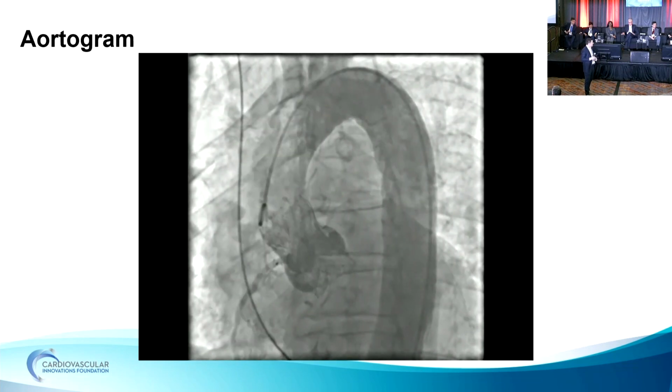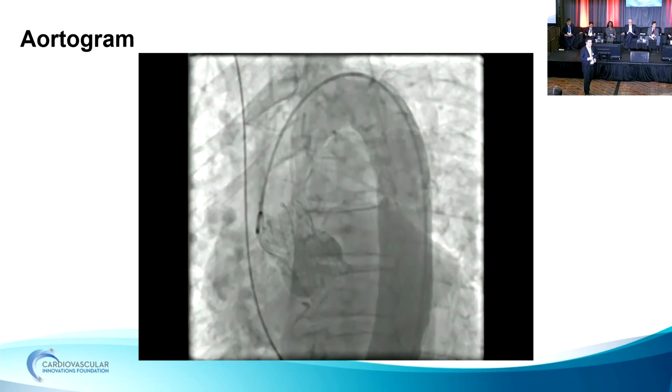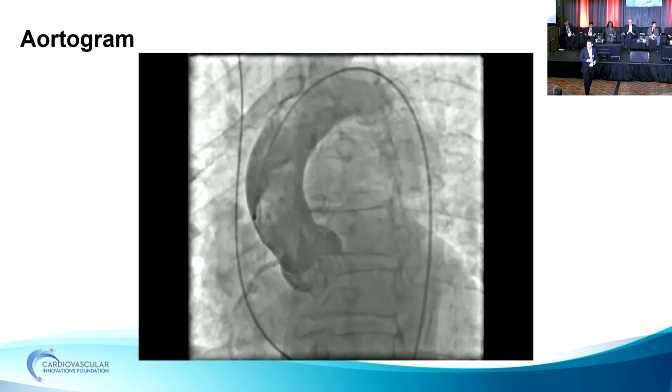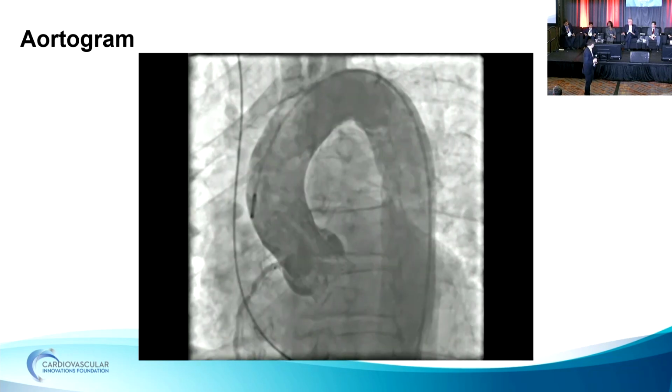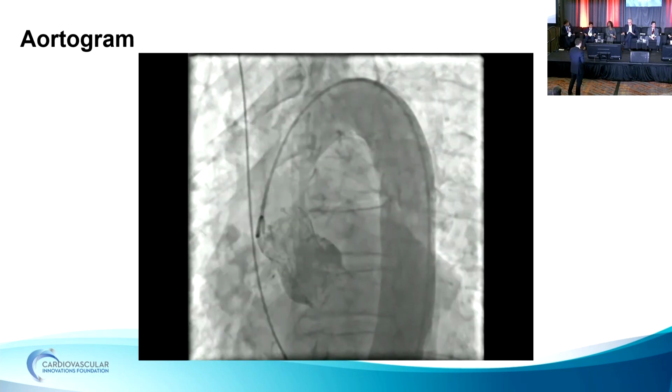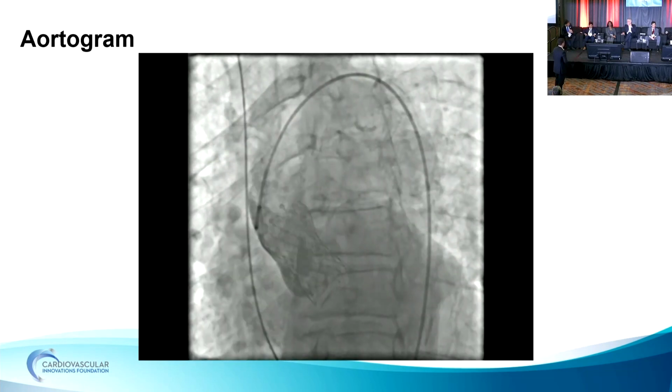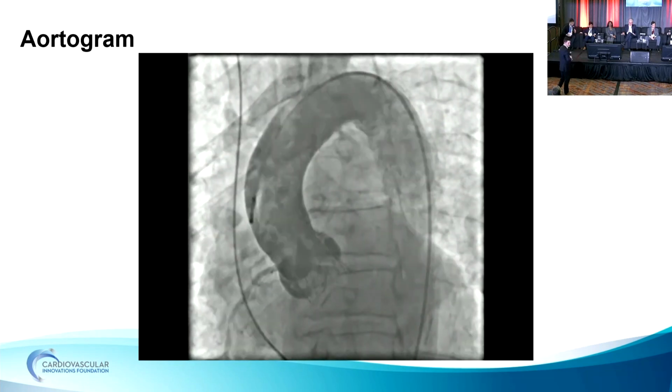So for those who might have not seen it, we closed the left main. So it's an acute ostial left main occlusion. Maybe we take a second here and go through our panel. Anyone who wants to tell us what to do with this? I know, Rick, that you do. Taver or Rajiv, anyone have thoughts about what to do next?